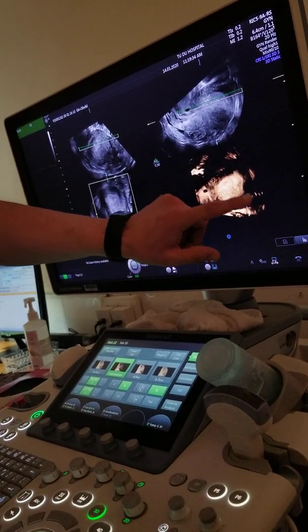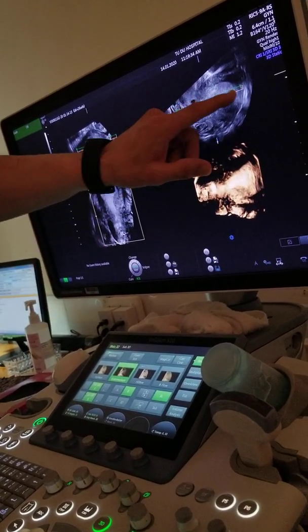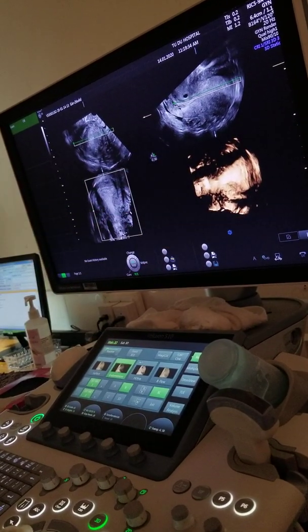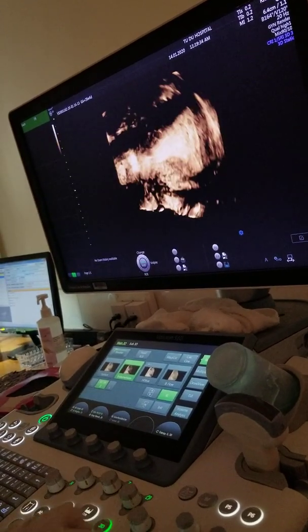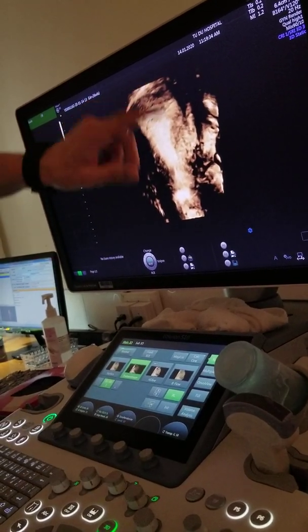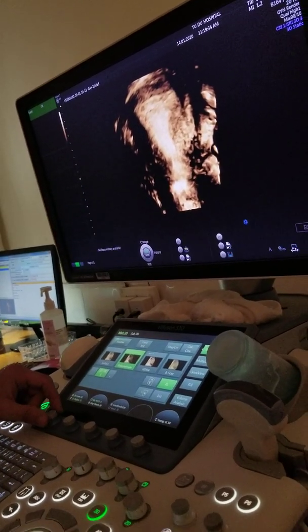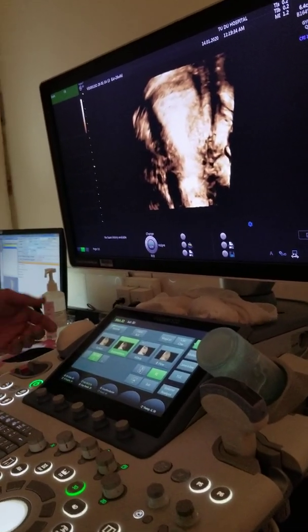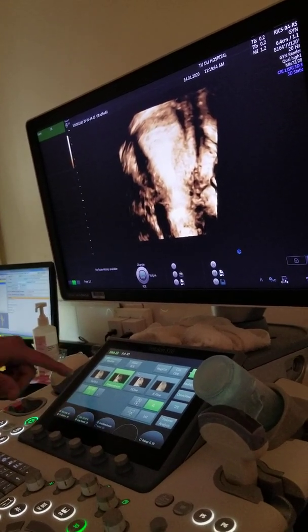And there's a little bit of shadow here, you see, because of this shadow here. So it's okay. But you want to see the serosa. So you have to bring it this way. Yeah, you see? Now I see the serosa. And it's perfect. This shows it. So we go to this one alone. Rotate. Perfect. Yeah, and now it's perfect here. But let's see if we can highlight this area. So what we do, try to contrast and the brightness. Yeah, you see? And then you can mix here between the two. And you can try different things.